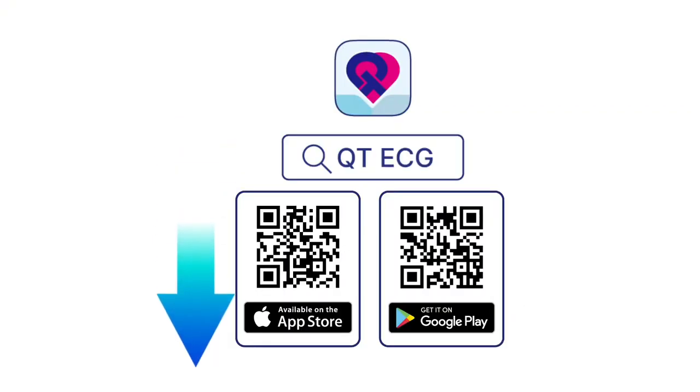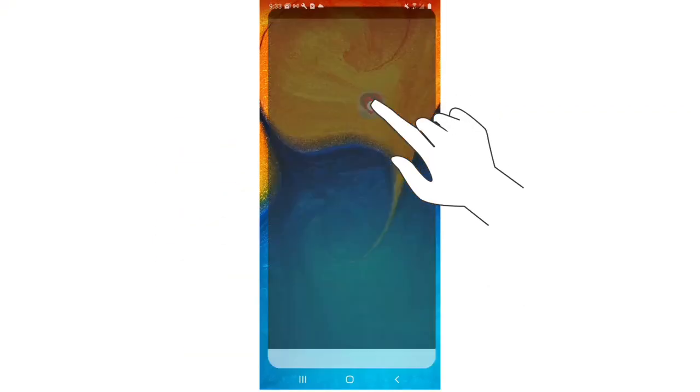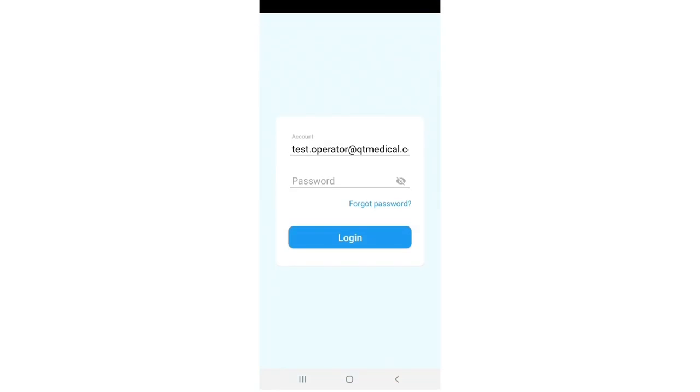Download the QTE-CG app. Tap the app icon to open the app. Enter your user account and password and press the login button.